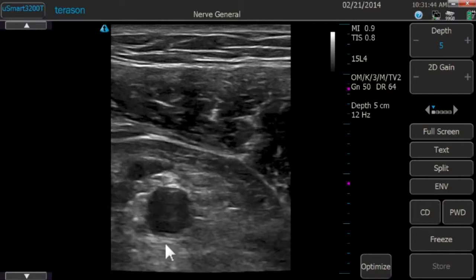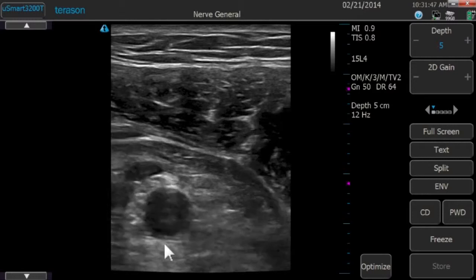That six o'clock position is at least our starting point. There's data showing you can put all your local anesthesia there and have success without redirecting the needle. I like needle redirection for a few reasons: it hedges your bets, allows you to put a little local anesthesia in each location, and enhances spread beyond what diffusion alone can do. The multiple injection technique also allows you to lessen the amount deposited in any one place, reducing the potential harm of an inadvertent intravascular injection — 25 milligrams versus 150 to 200 milligrams of local anesthetic.